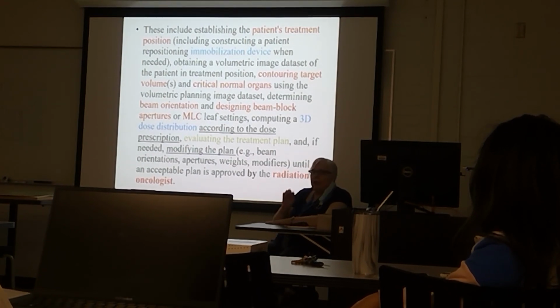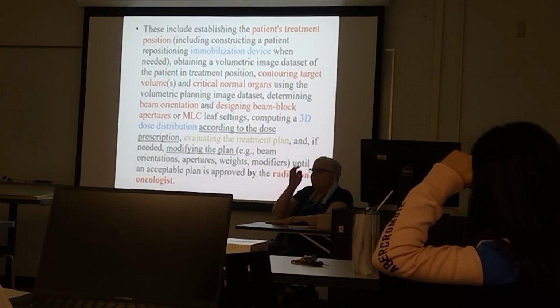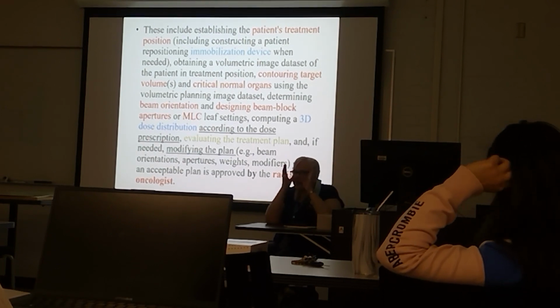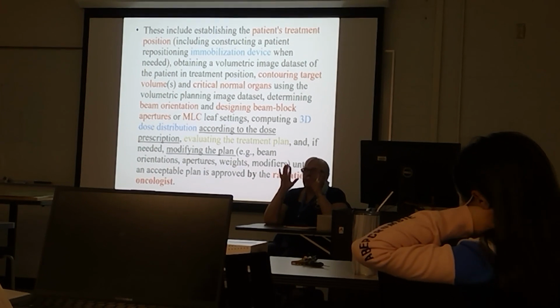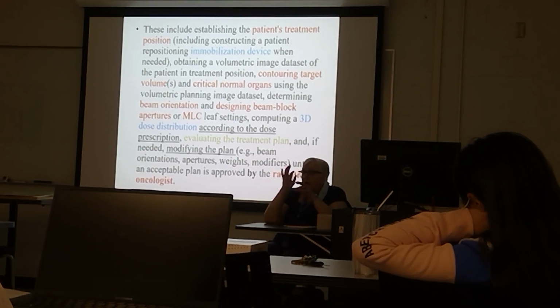However, because the prostate moves, the fiducials move. So some departments will have you match the prostate seeds from the CT and the cone beam CT first, and then go with the prostate. So it may not be the same thing.